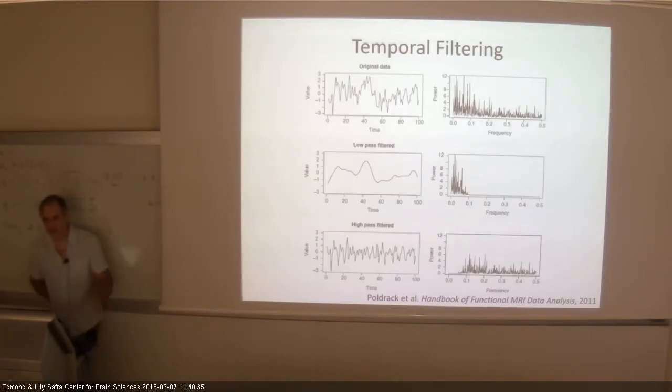Where is our signal, the things we're looking for? Maybe I'm not giving you the whole information. I'm talking about really high-pass, removing the very low frequency. If you have a 5-minute scan, I want to remove something that is 2 cycles within the scan, something very slow along 5 minutes.